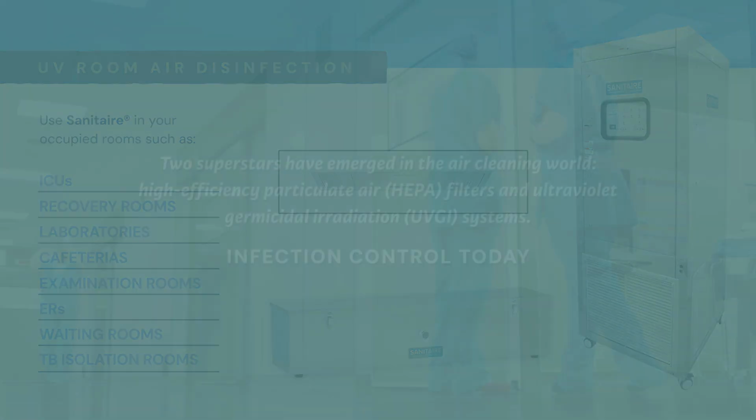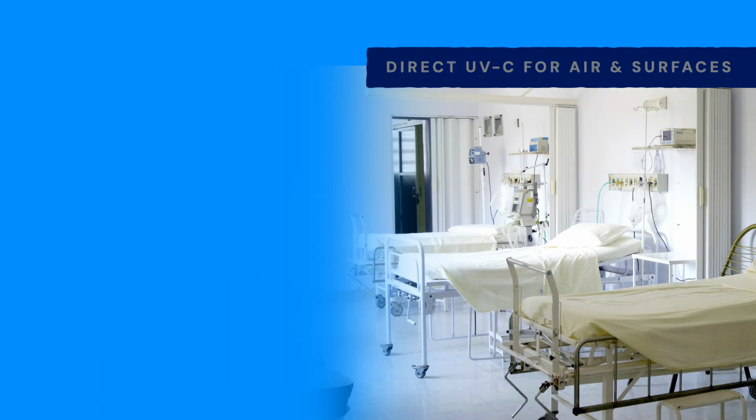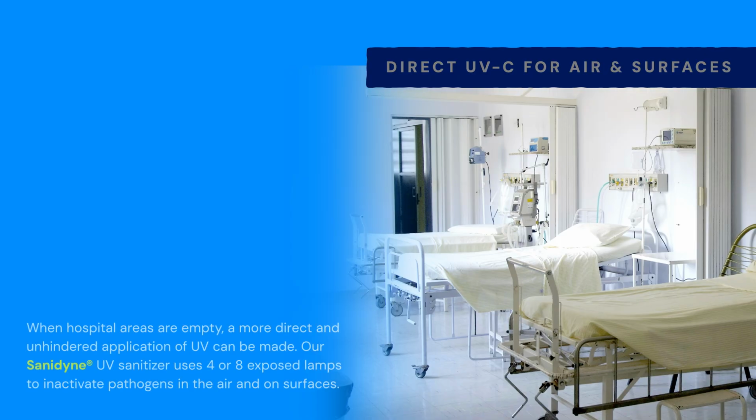Two superstars have emerged in the air cleaning world: high-efficiency particulate air filters, and ultraviolet germicidal irradiation systems. Infection control today. Direct UVC for air and surfaces. When hospital areas are empty, a more direct and unhindered application of UV can be made.